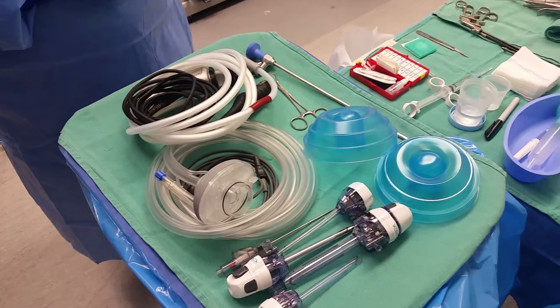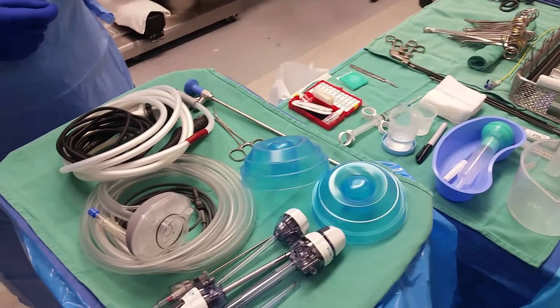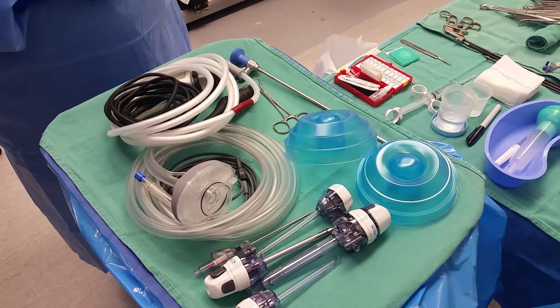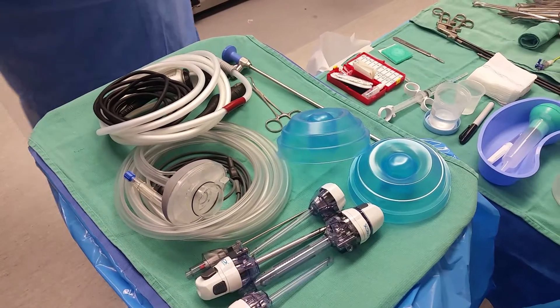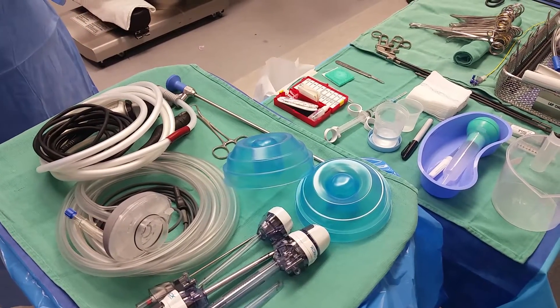Hello, this is your basic setup for an intraoperative cholangiogram with a laparoscopic cholecystectomy. Remember, your setup doesn't necessarily have to look like this. Your main key is to make sure it's sterile, but this is a setup that works for me.